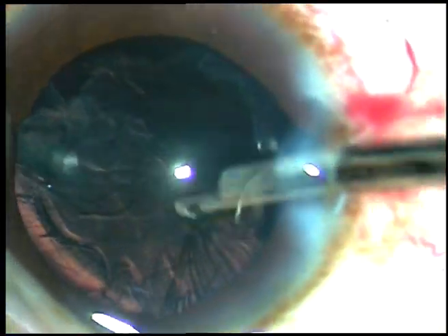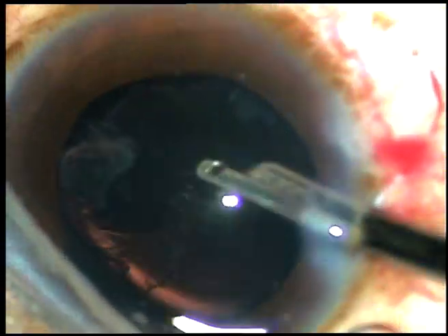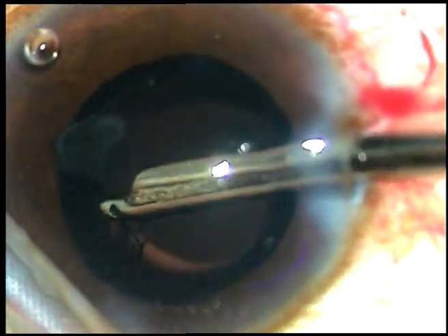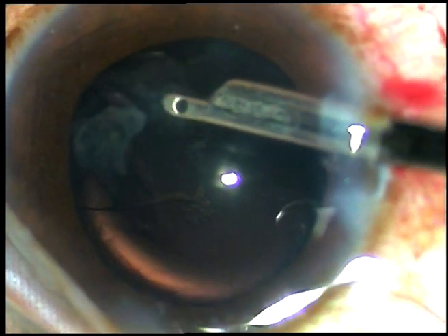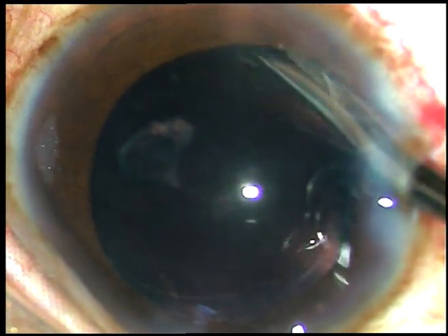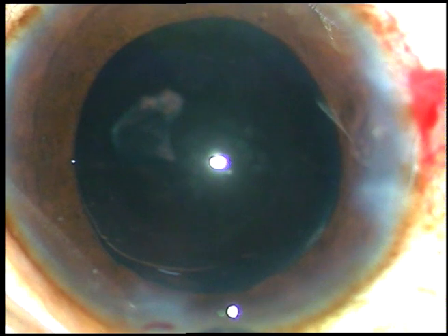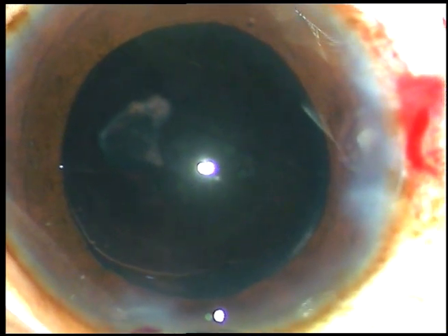Now I am using a 23-gauge Simcoe cannula just like you use a coaxial I/A. I am using the main port — not the side port — with the help of this very simple instrument. You can clean the cortex, and for every case you can afford to have a new Simcoe.